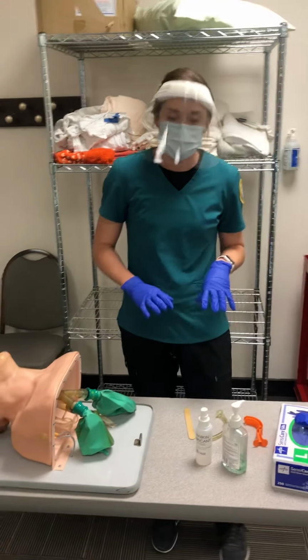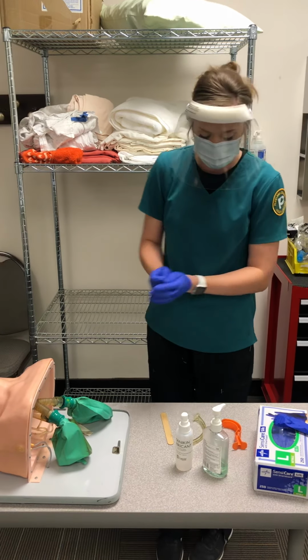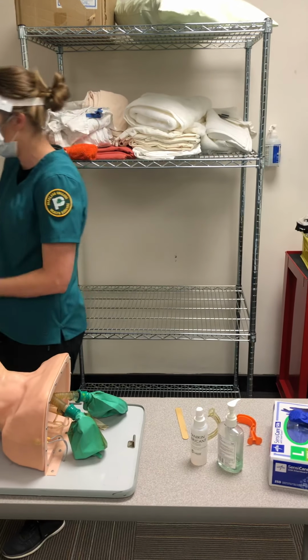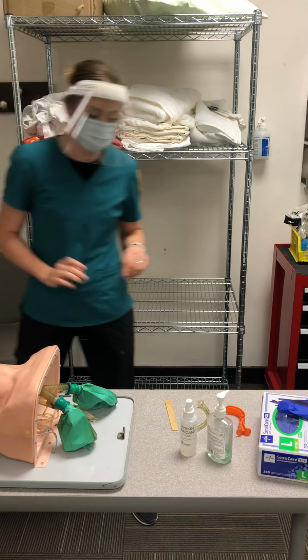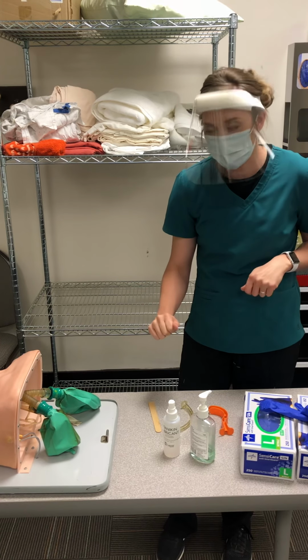Next, I will be doing the nasopharyngeal airway. Again, first thing that I will do is review the patient's chart and verify doctor orders. I will then knock on the door because this patient will be conscious.